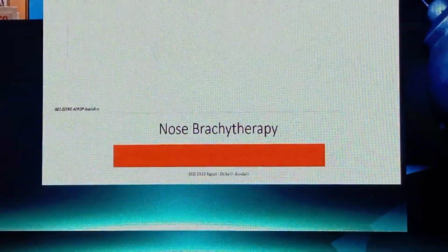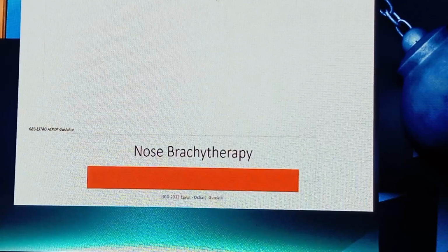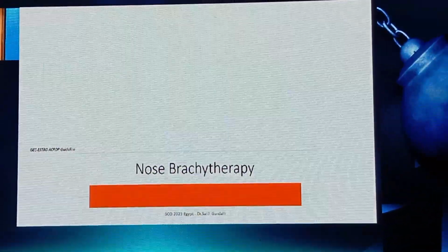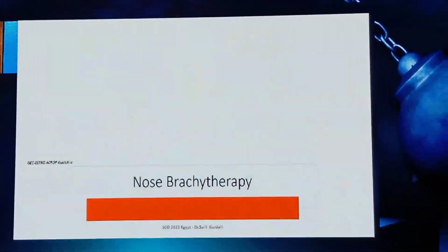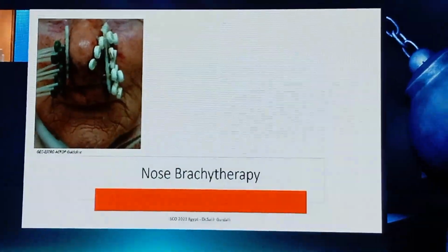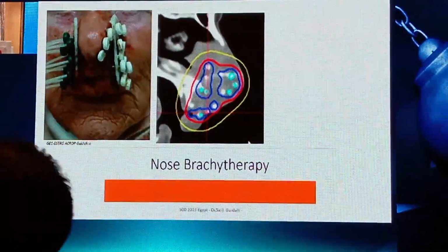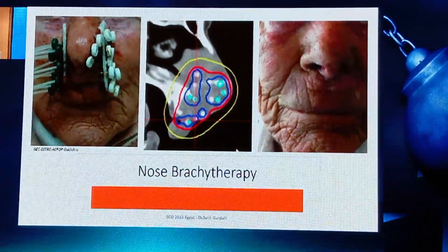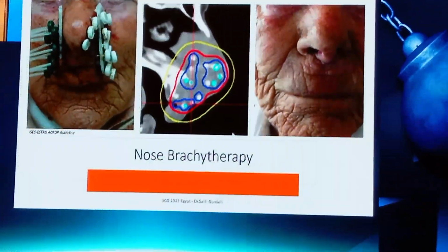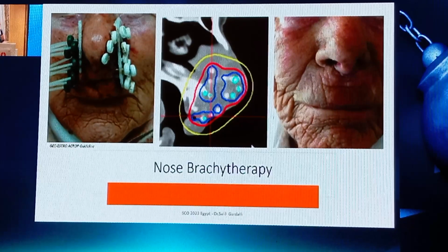As this is not a clinical session, I just put some examples, but I strongly recommend you get these articles and dive deeper to get much more clinical results and details. Okay. And this is a nose applicator. It sounds and looks a little bloody, but when you check this, I think it's worth it to have that kind of blood to get a skill-based result, and she's an old lady, by the way.